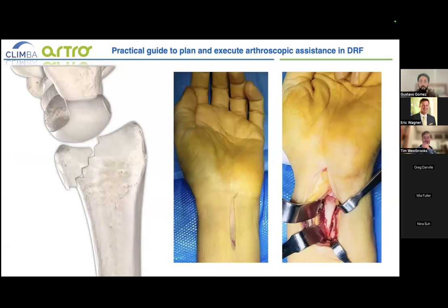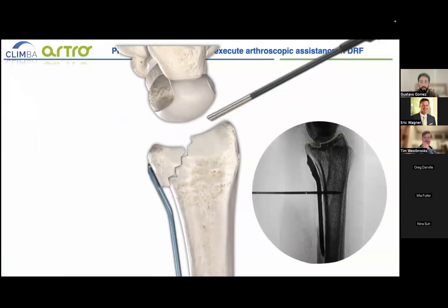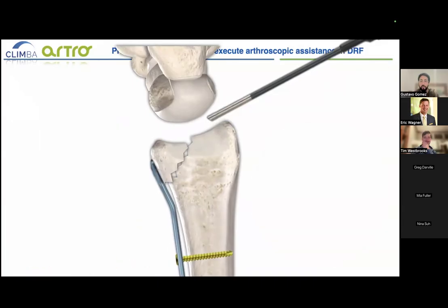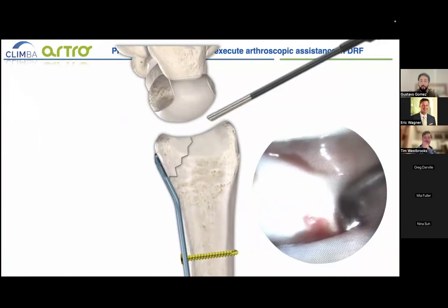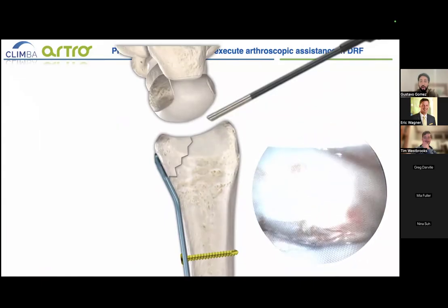If the fracture involves the volar ulnar corner, I strongly recommend an ulnar approach, going ulnar to the palmaris longus, so we can have better access to reduce the fracture. And to fix the plate, we place the scope at the 6R portal, and we use the plate to reduce the fracture with the proximal compressive dynamic screw. We can control the reduction under arthroscopy.